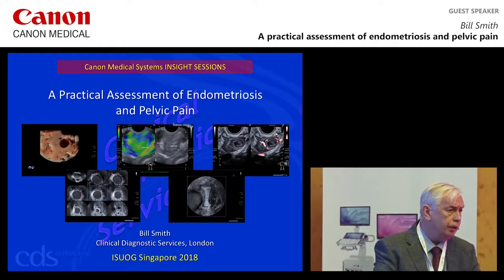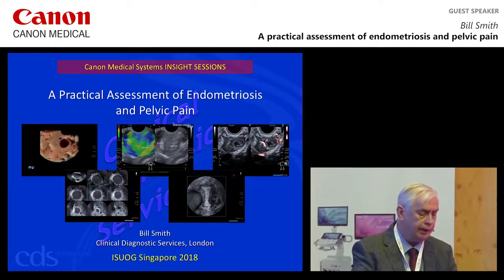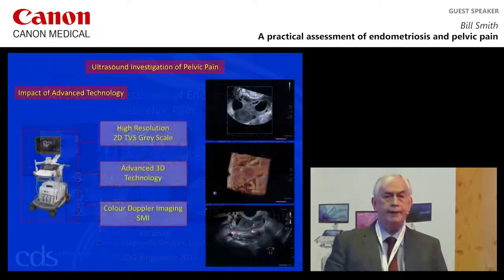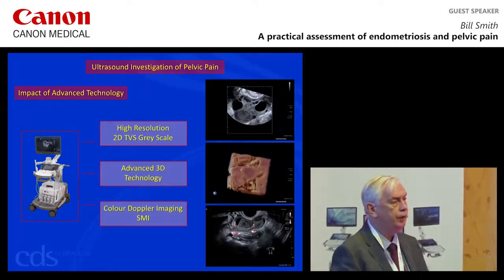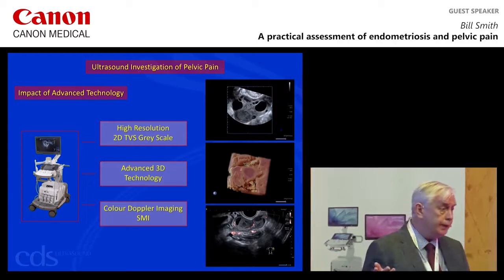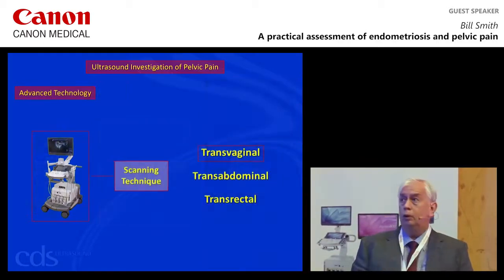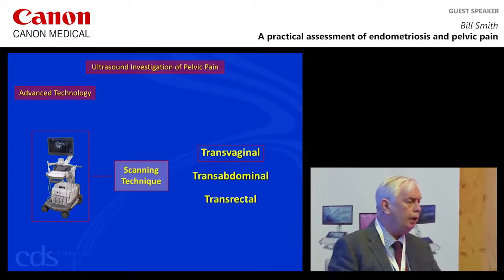Modern ultrasound offers us an amazing range of technologies now in terms of assessing gynecological disease and associated functional disorders, whether it's the actual imaging modalities that we have available to us, or our scanning technique.